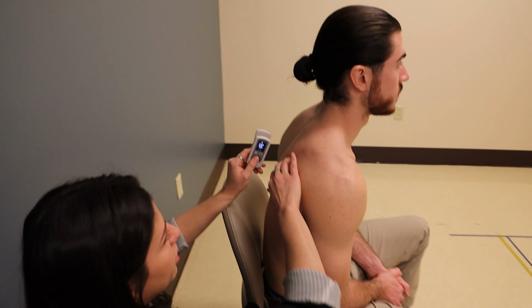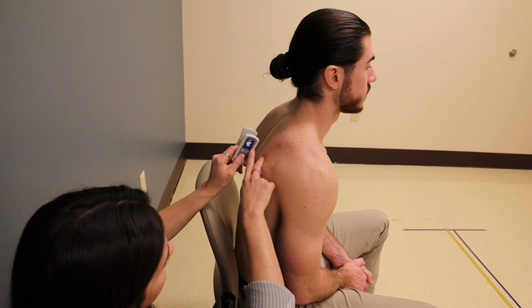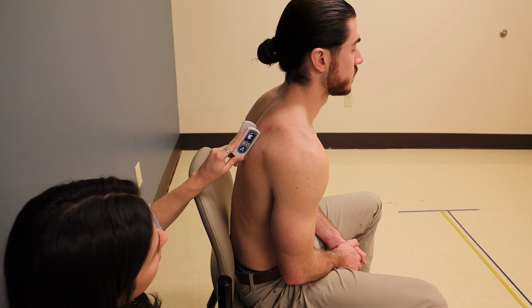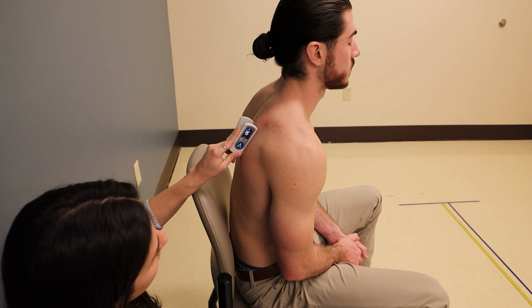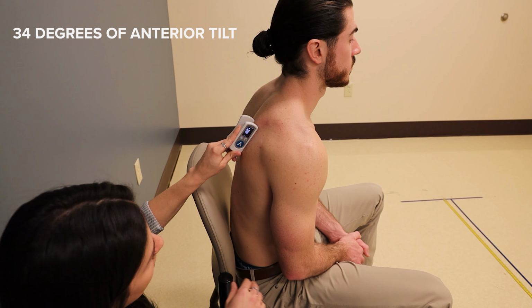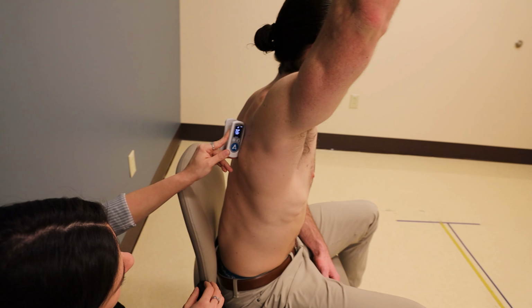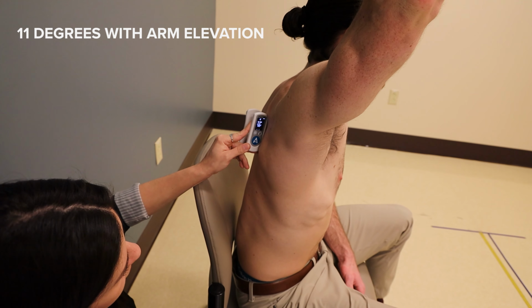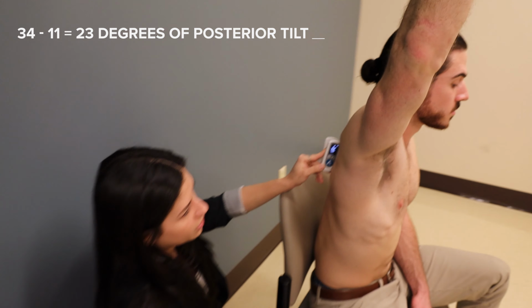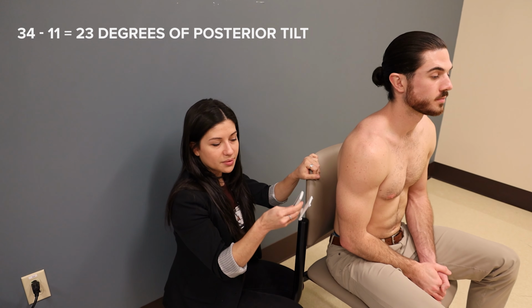So the medial border again is really easy to palpate. So you just find that medial border and then this part of the Easyangle is actually gonna come in contact with that medial border. So he's resting in about 34 degrees of anterior tilt. And then I'm gonna have him elevate his arm. So he's staying in close contact. And then now it's at 11 degrees. So 34 minus 11 is 23. Go ahead and relax. So he posteriorly tilted 23 degrees.